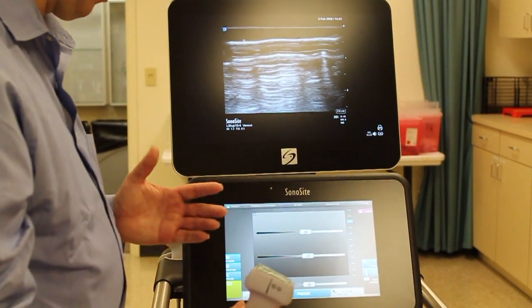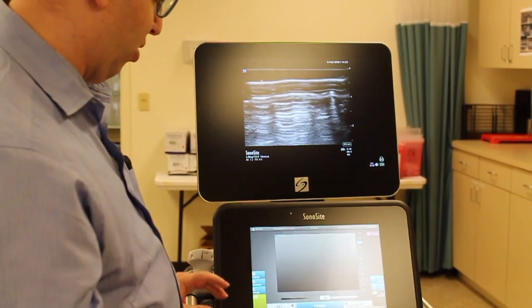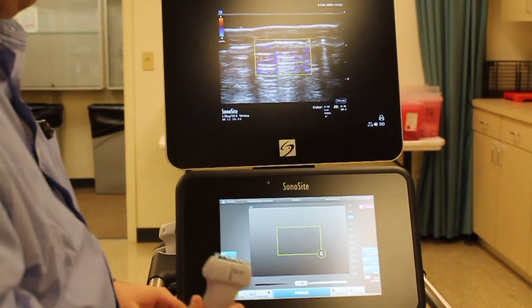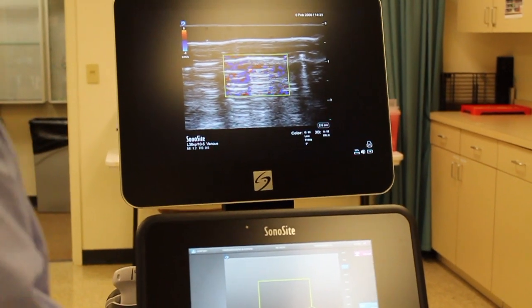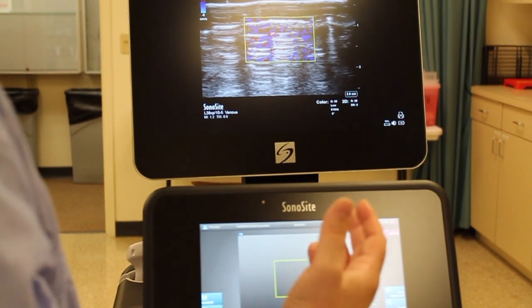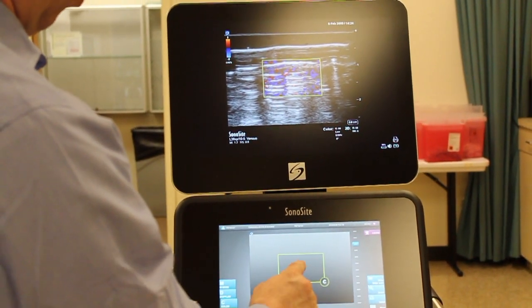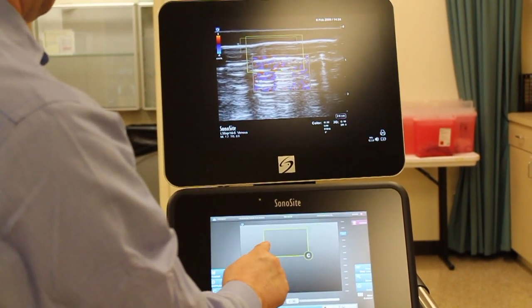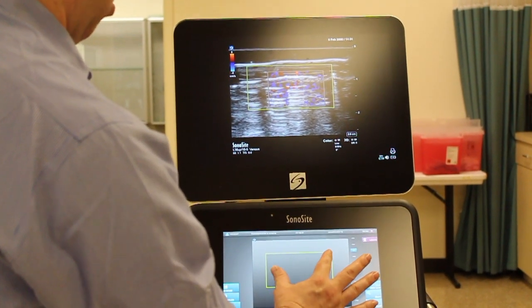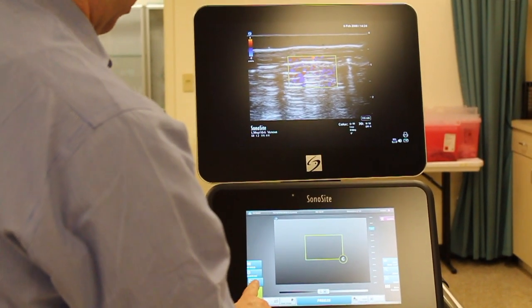The next thing we want to look at from time to time is color. On the side here we have different modes — we're not going to look at Doppler today, that's more of an advanced thing, but we will look at color. When I touch the color tab on the left, I get a pop-up window that's going to allow me to provide color, which is useful in identifying blood flow through structures. This window can be manipulated and moved around to cover different parts of the screen — we can expand it or shrink it, and we can apply the color. To turn off the color, I simply press it again.